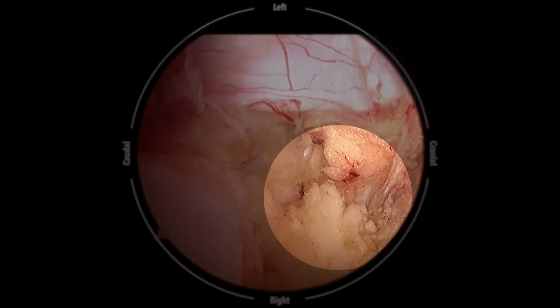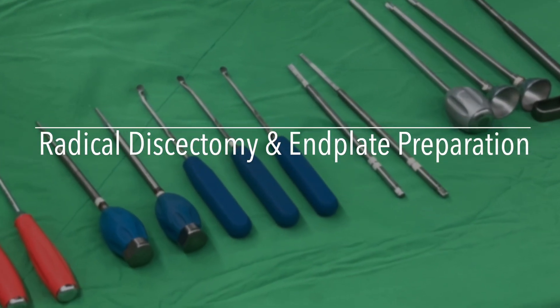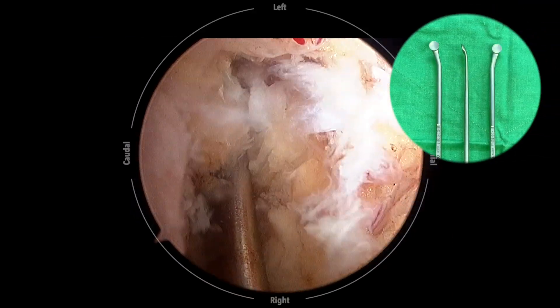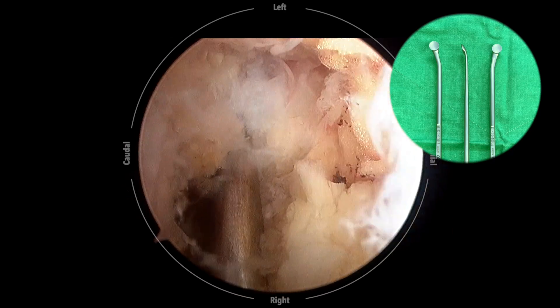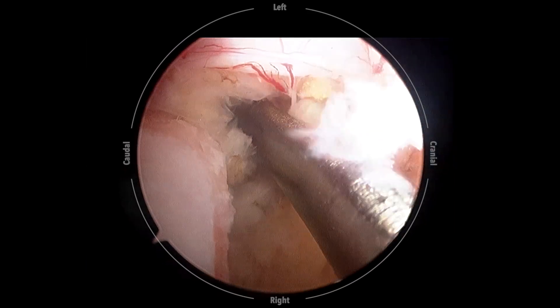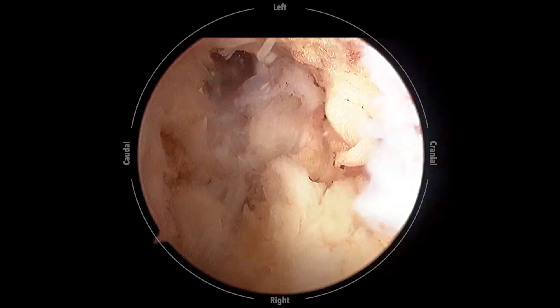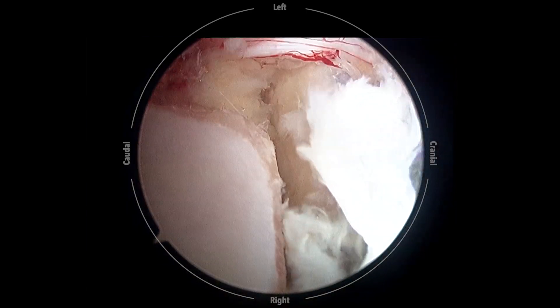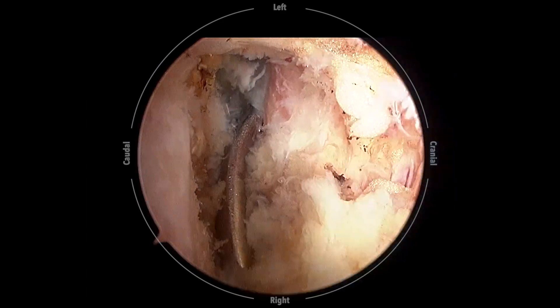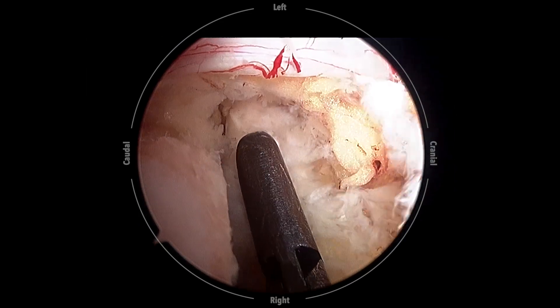For effective disc removal and preserving the bony endplate, we designed a new set of endplate strippers with three different angles to strip the cartilaginous endplate away from the bony endplate. The various angles of the strippers can reach the deep contralateral corner in the disc space. The disc is removed in large pieces along with the cartilaginous endplate. We never use disc shavers or curettes due to concerns about bony endplate injury.